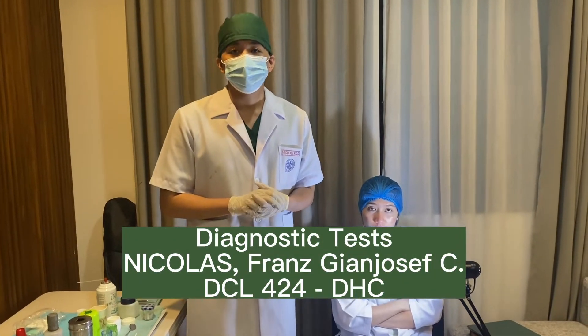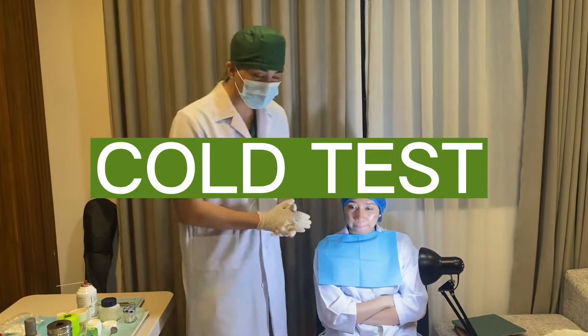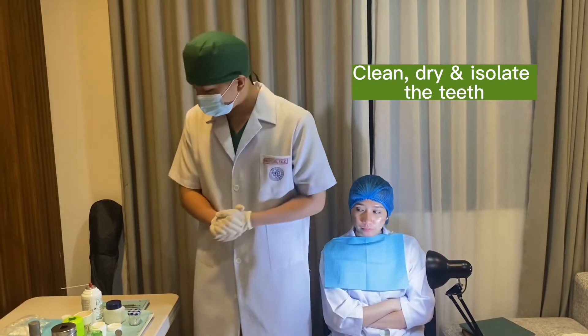Good day! I will now be doing diagnostic tests. The first thing that I will do is a cold test on this patient. I will now clean, dry, and isolate the teeth first.